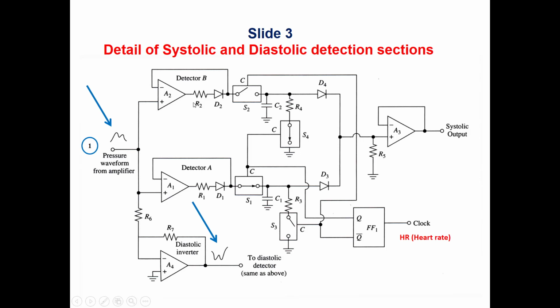This is exactly similar to the power supply, where we have a sine wave, and after entering a full bridge, we have a rectified full wave. Then we put a capacitor in order to make smoothing. By doing this, we are really measuring the maximum. So imagine we have a sine wave and another sine wave. When we put a capacitor, we make a smoothing for this signal, and then we can have the reading of the maximum or the amplitude, which will be the systolic.